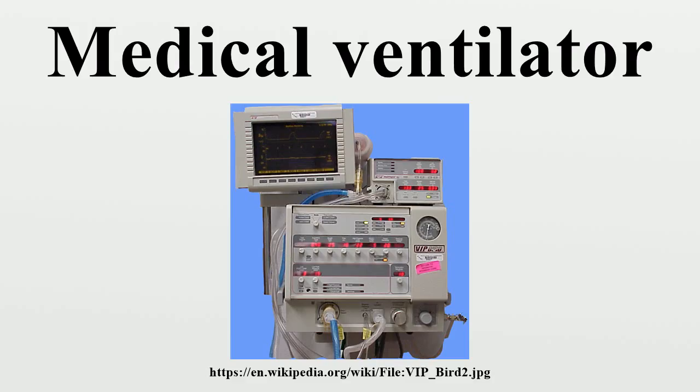Function. In its simplest form, a modern positive pressure ventilator consists of a compressible air reservoir or turbine, air and oxygen supplies, a set of valves and tubes, and a disposable or reusable patient circuit. The air reservoir is pneumatically compressed several times a minute to deliver room air, or in most cases, an air-oxygen mixture to the patient. If a turbine is used, the turbine pushes air through the ventilator, with a flow valve adjusting pressure to meet patient-specific parameters.